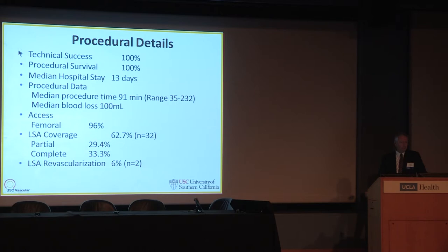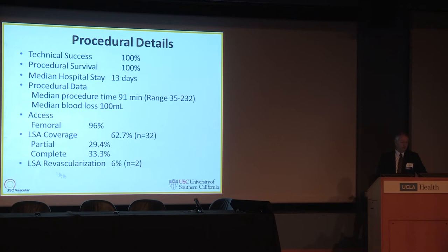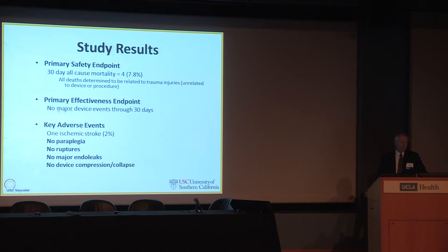The Gore trial looking at blunt aortic injury showed really superb results and was the first prospective analysis of endovascular treatment of blunt aortic injuries. High technical success, procedural survival of 100% — mortality occurred in patients from other existing injuries, not the aortic injury. The left subclavian required coverage in a majority of patients, but revascularization was very uncommon. All-cause mortality was 7.8%, with no major device events and very few key adverse events.